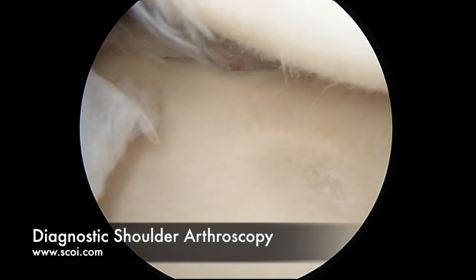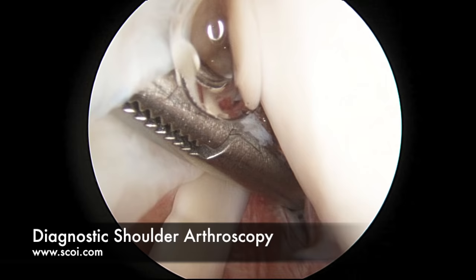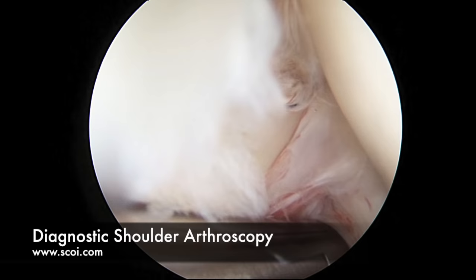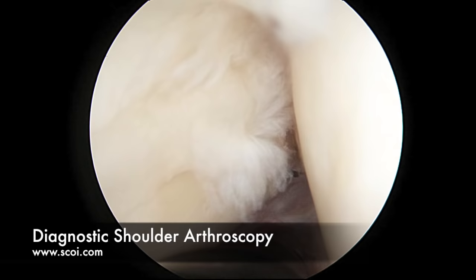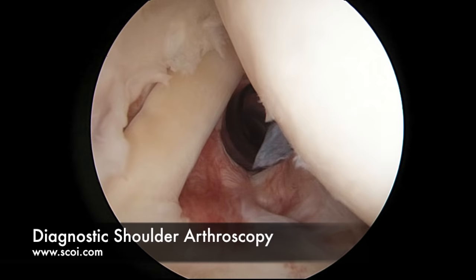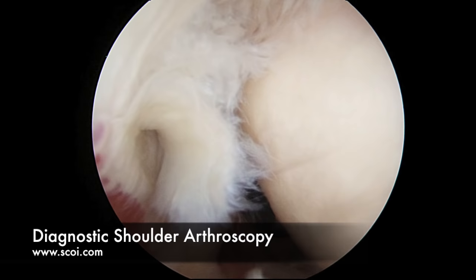Then we'll come up and look at the undersurface of the rotator cuff, which is a group of tendons that come from the left side of the screen up to the superior aspect of the shoulder. We'll look for a full thickness tear, partial thickness tear, and the like. In this patient there's a little partial thickness tearing — you'll see little frayed ends of the tendon there, but we don't see a full thickness hole. We'll debride that back and establish how much intact fiber is present. There is certainly a partial thickness tear of this rotator cuff.